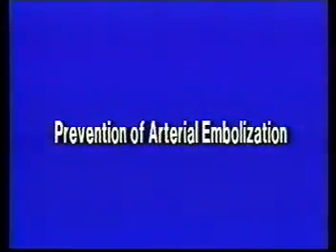Please discuss methods to prevent arterial embolization. Arterial embolization is a potential complication of any percutaneous or surgical thrombolytic procedure. Arterial embolization can be avoided by not over-injecting contrast into the graft while it is still clotted. This is probably the single most important preventive measure. In addition, one must be careful when deploying the PTD near the arterial anastomosis in order to prevent the basket from dislodging clot into the artery.